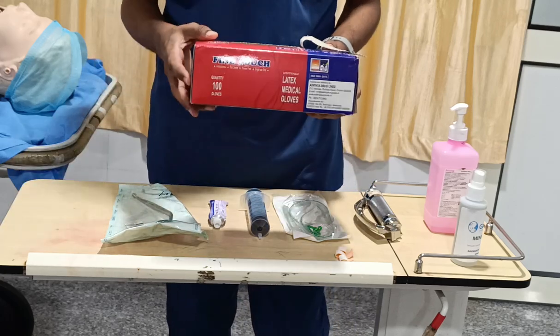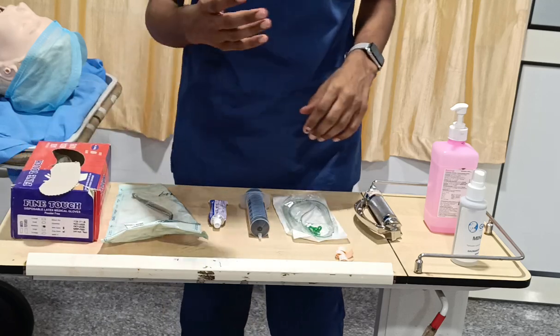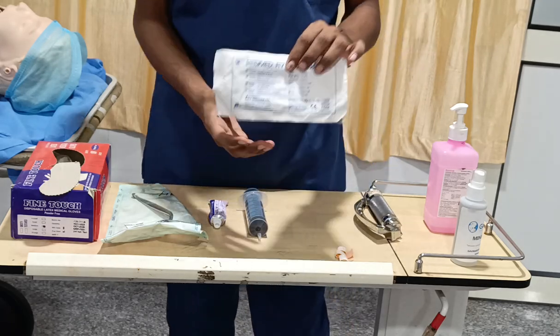So you should have your gloves, and then mask. If needed, you can go with your gown also. Second thing, I need your Ryles tube. That is the hero of this procedure. So you have to take the Ryles tube.